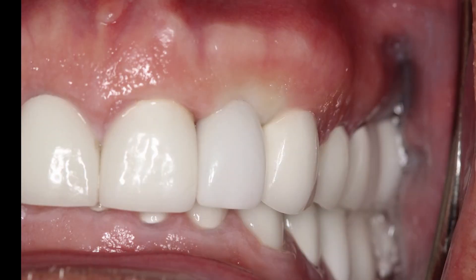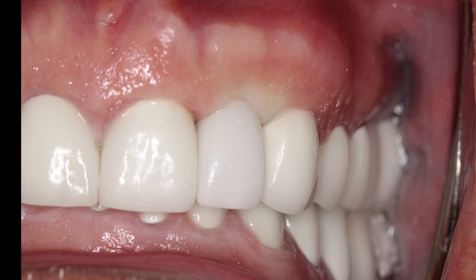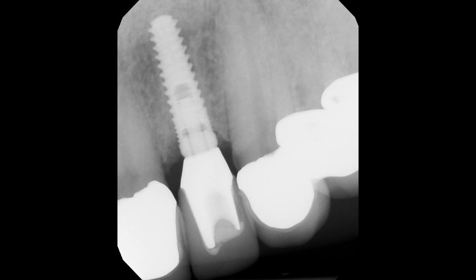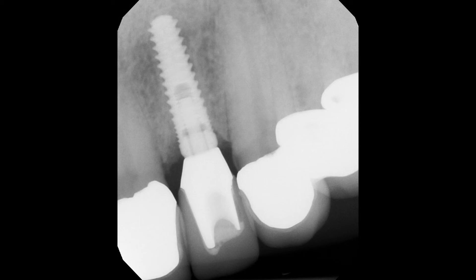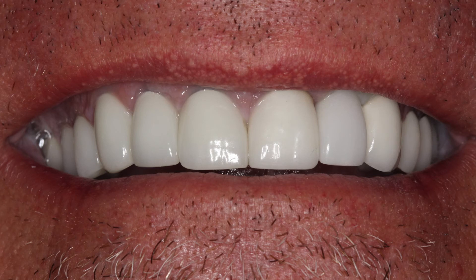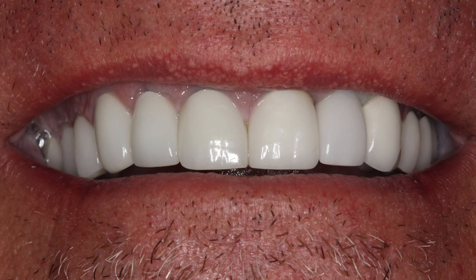In figure 7, we see the fully seated implant retained crown and final seating radiograph, which illustrate the slightly subgingival margin established by the custom abutment. The accuracy of the digital impression and design processes ensured proximal contacts that eliminate any dark triangles in the interdental papilla. Our final photograph shows that our patient was extremely happy with the final aesthetic result and had a smile line that was improved by the implant retained restoration.